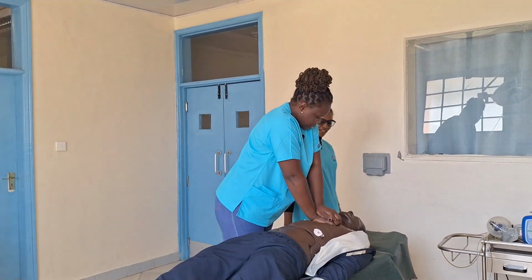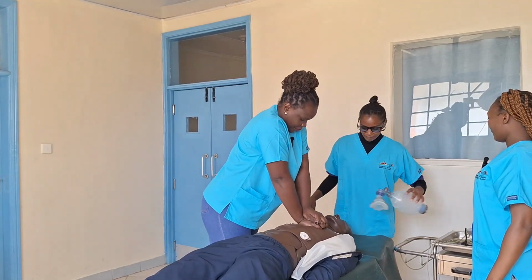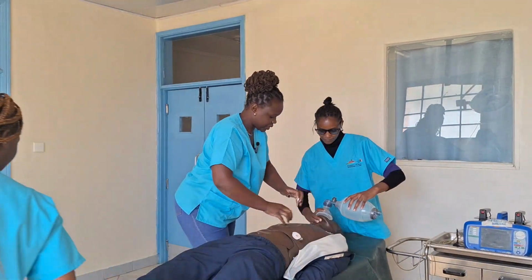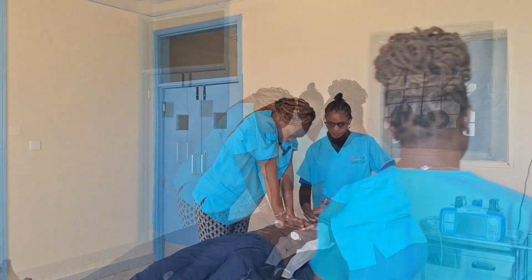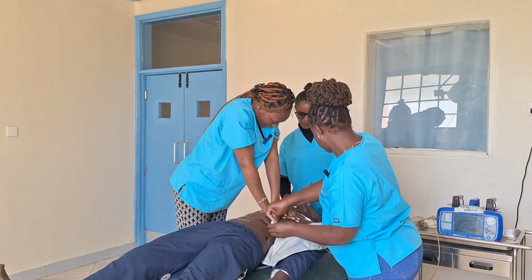Please grab the BVM and support the airway. Please give 2 rescue breaths. Jackie, please take over compressions. Thank you.